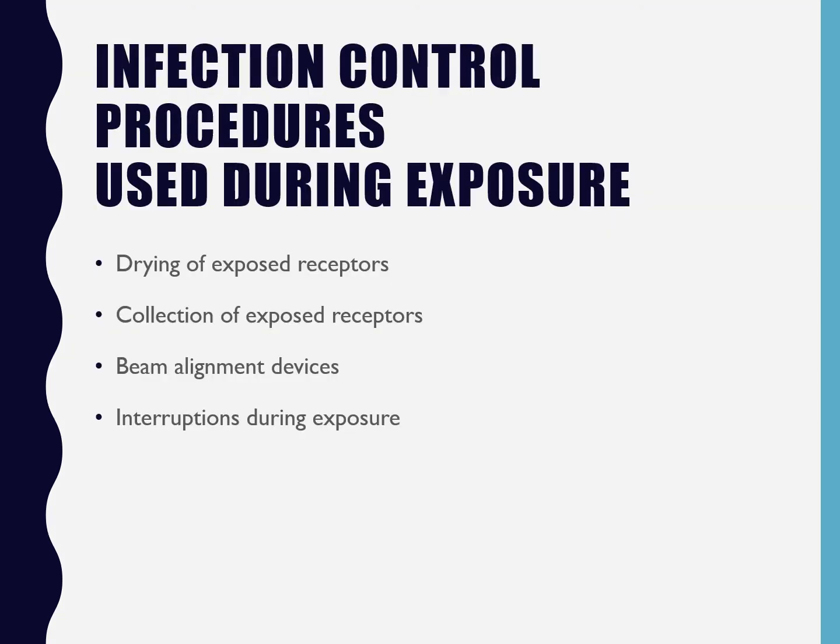Okay, so during exposure. Now, I'm going to talk to you a little bit both about how we would do it with sensors and how we would do this with film. This might take a little bit longer than maybe you're hoping. Anytime you take a radiograph, you'll go in, you'll place it in there, and when you bring it out, there's saliva on it, and so it's wet. Sometimes there's a little string of drool that you have to clean up. And so every time you take that sensor out, unless you're not doing anything with it, you're just going to stick it right back in there.